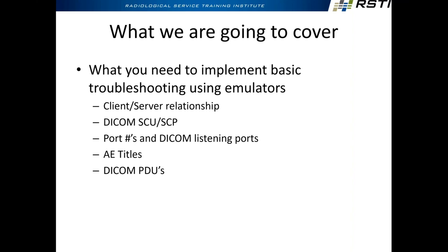Port numbers and DICOM listening ports. A lot of you out there have probably already configured DICOM devices before, using all kinds of different port numbers. You probably know the default port number 104, but they can be required to be dynamic. They're static port numbers, but they're required to be configurable, so they may be something different. But 104 is the default, the ACR-NEMA registered port, so you'll see that used quite often.